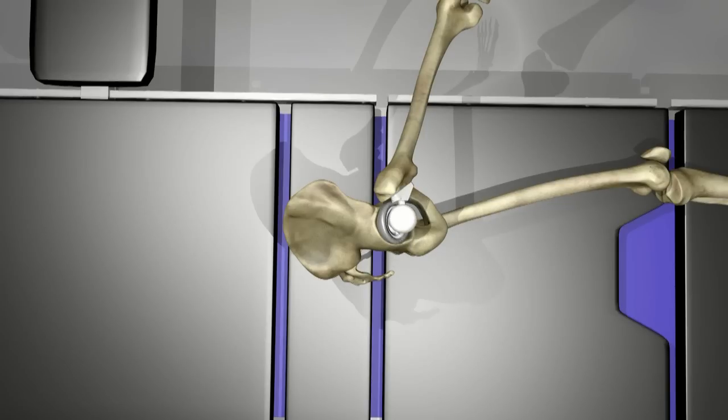The components are cemented in place. The new femoral head is positioned in the new socket.